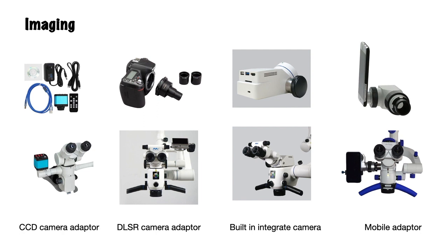Before one decade, CCD cameras were only able to do direct video transfer. But today, companies make CCD cameras that are able to do still images, video recording, and also camera settings. And we have another way, which is a single-lens reflex or professional digital camera.